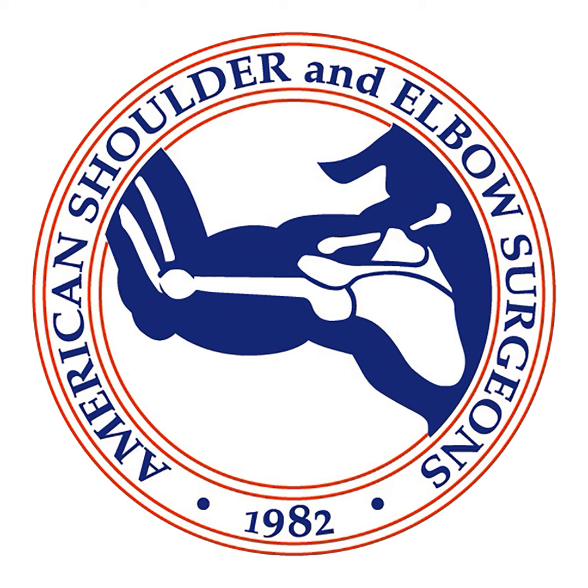Anything you'd add, Dr. Sperling? What do we miss? What are some other downsides of a long stem humeral component? Yeah, it's really interesting. I think Mike said it very well. I think the challenge, of course, is when we think about revision. There are some stem designs, fully porous-coated designs, some with unusual geometries that can make removing them extraordinarily difficult and can really result in significant destruction of the humerus.